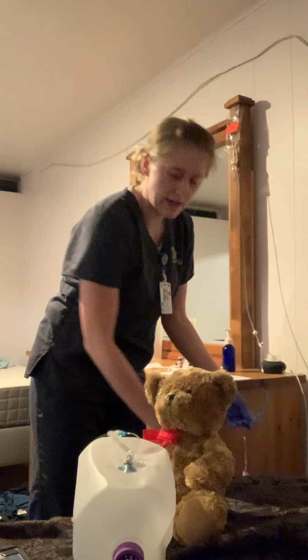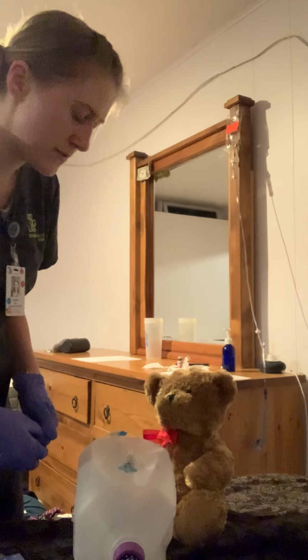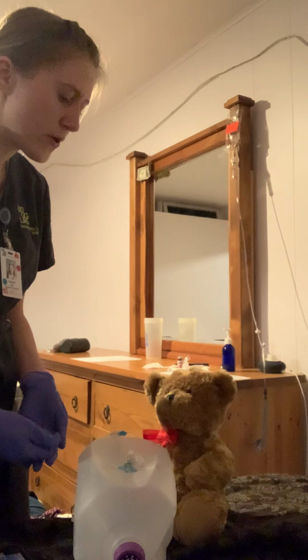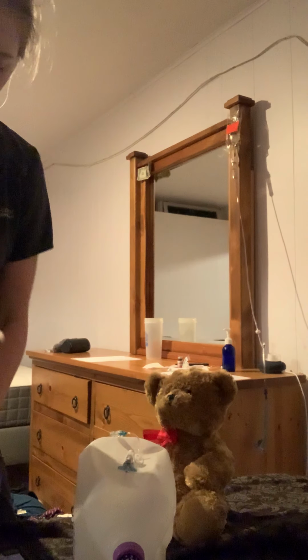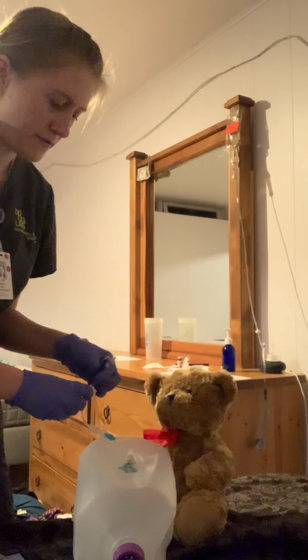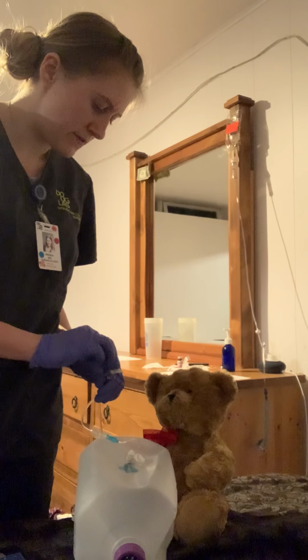All right, so now that that's stopped, I'd ask my patient, just assessing the IV site. I'm looking for any infiltration or phlebitis, so any redness, any swelling. Ask the patient if it's been bothering them at all, if it's been painful. Okay, now I'm just gonna prime the line. So I'm gonna take my alcohol swab here. I'm gonna close it off using the port closest to them. Circular motions for about 15 seconds.